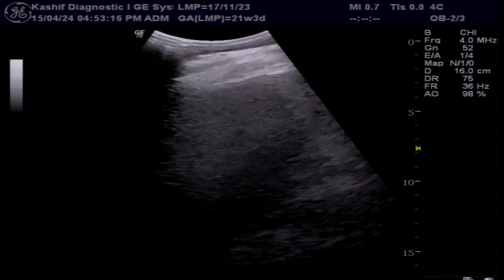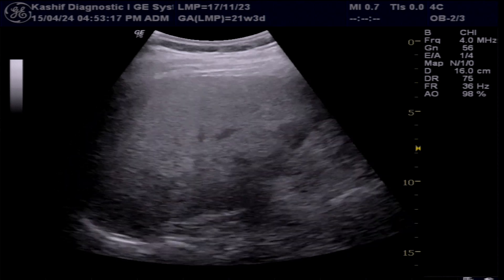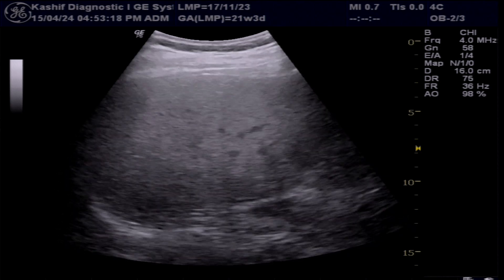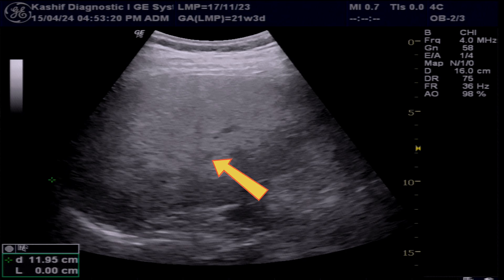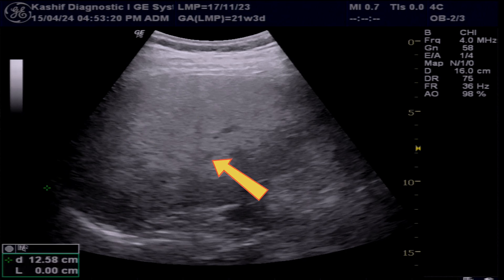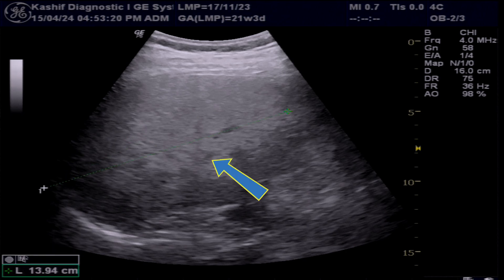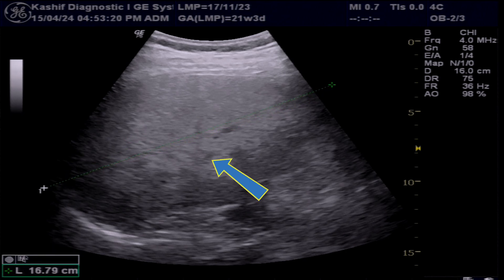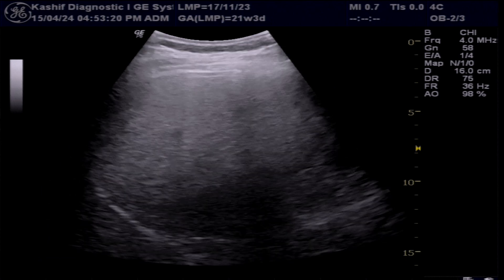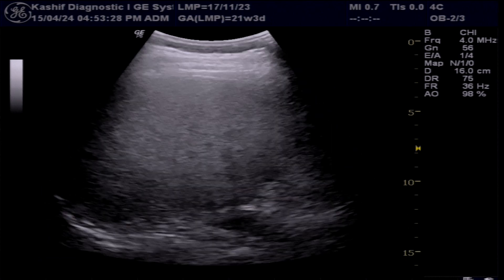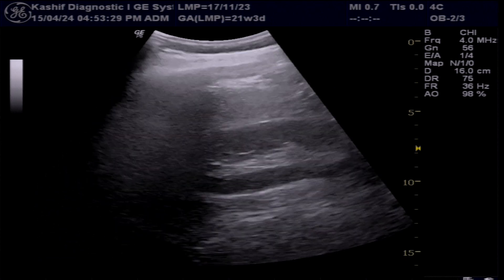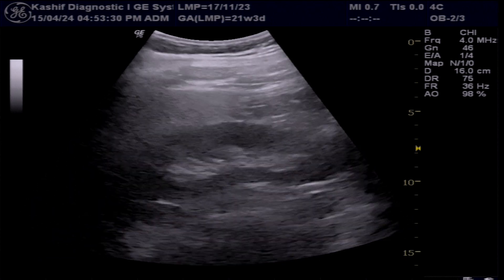We can see the liver, which is enlarged at 16.8 centimeters. There is moderate-plus hepatic fatty changes.